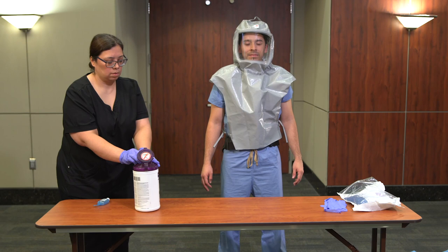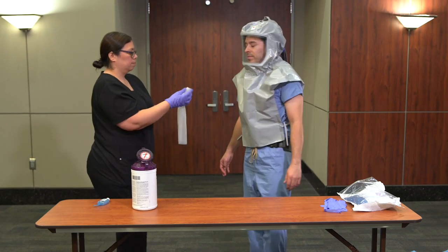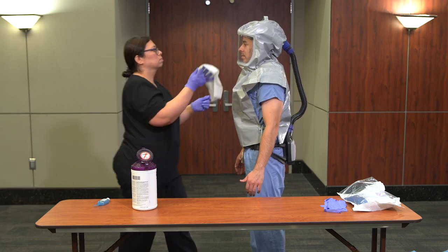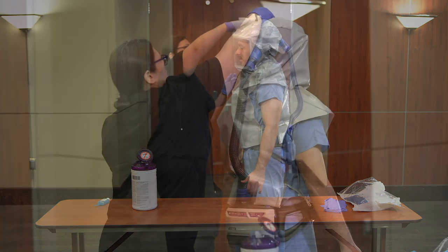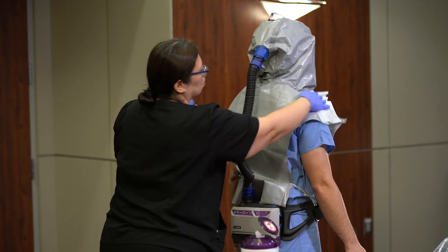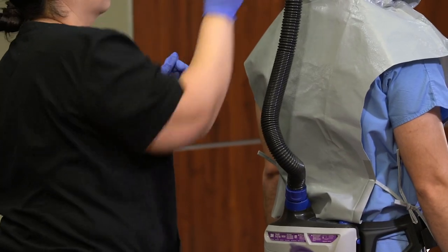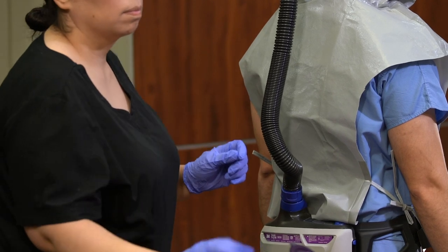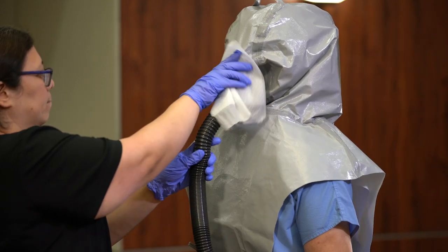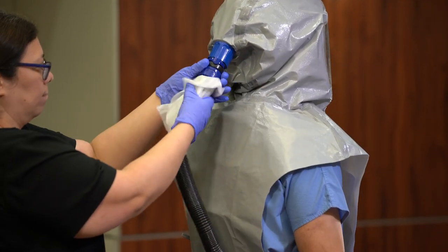The buddy should disinfect the outer portion of the PAPR in the following order: wipe the exterior head cover and visor, then discard the wipe. Wipe the exterior of the hose starting at the back of the hood and working down to the blower assembly.